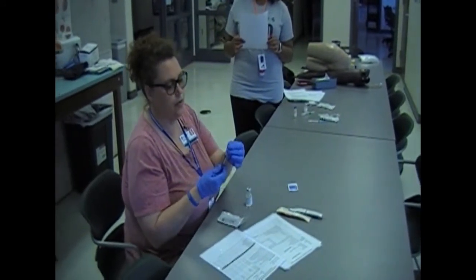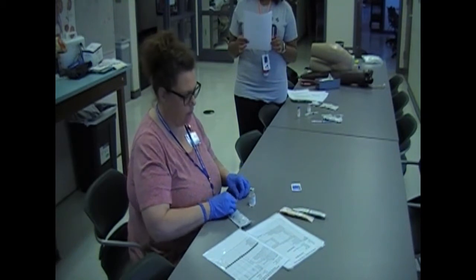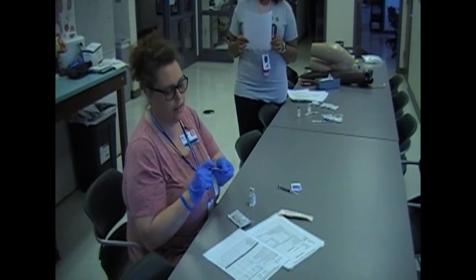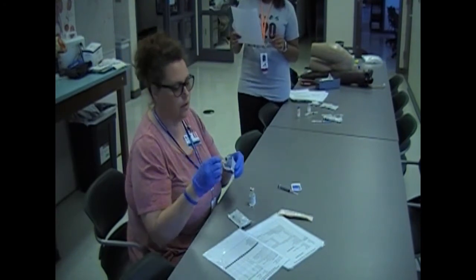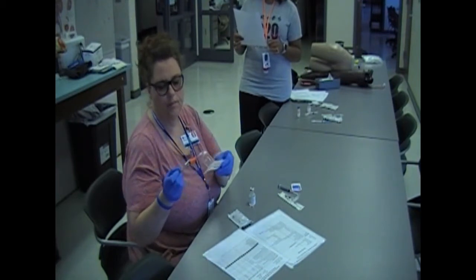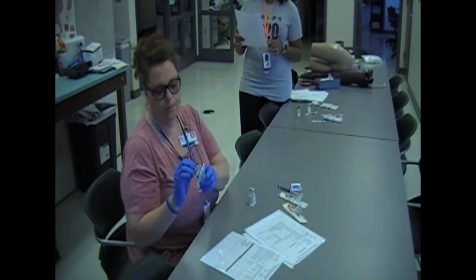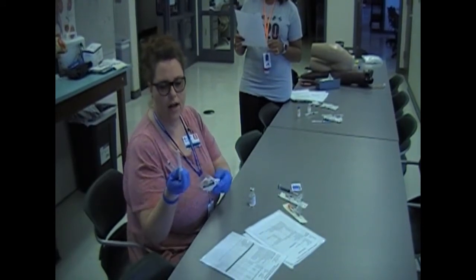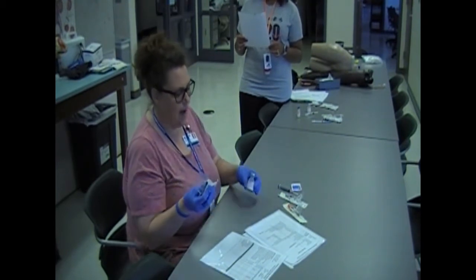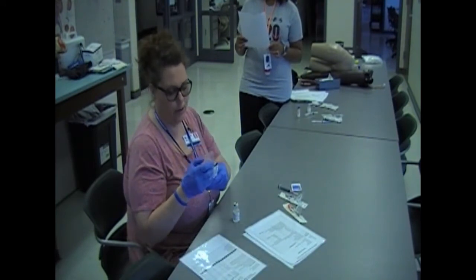So on this, in your bag, you have your sub-Q needle, your insulin or your tuberculin needle, this is your insulin, and then your IM. And this is your IM. Okay, so this is an IM injection. I've already looked at my med twice, and I've selected my IM needle.